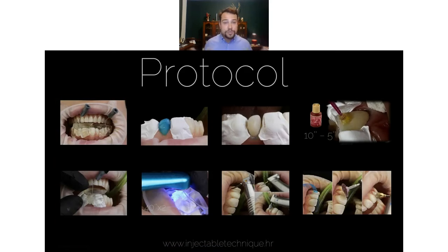So to sum up the protocol, we have etching, isolation, bonding, application of the composite, light curing, finishing, and polishing. Like for any other composite restoration, it's just that we are applying the material that we are using, usually flowable composite, in a little bit different way while injecting in the transparent silicone. Okay, so the idea is to think out of the box. So I prefer to call this the concept, because we are copying our wax-up.